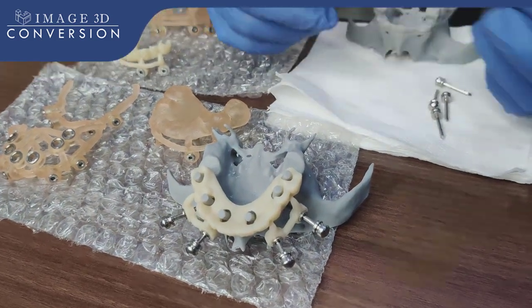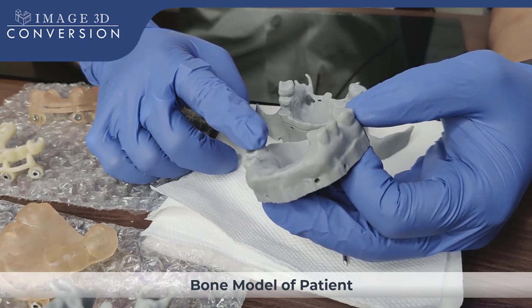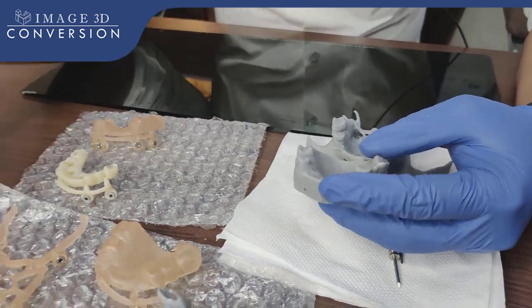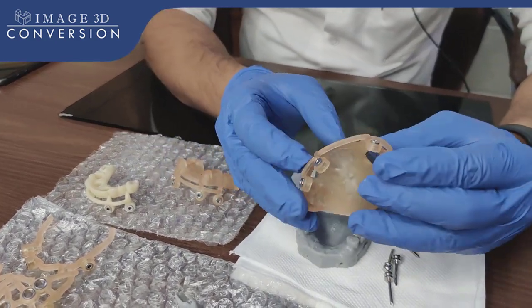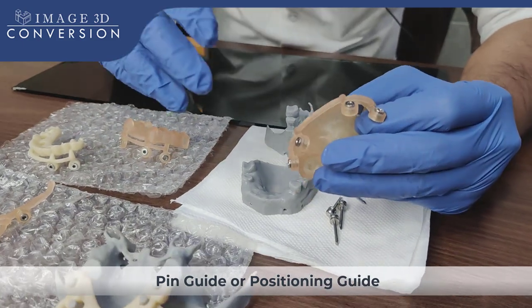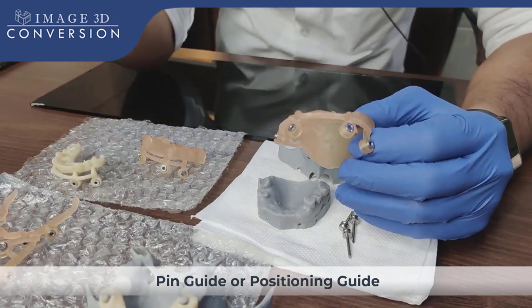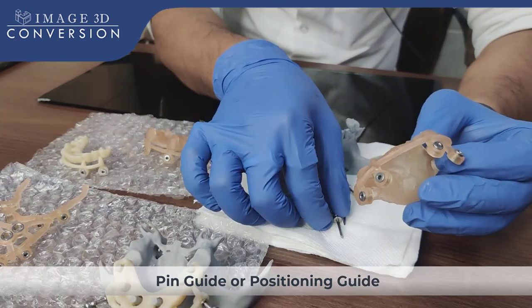This is the model we have. This is the intraoral scan — we had to superimpose this intraoral scan over CBCT using the software. We use Blue Sky Plan software. If you go through our previous videos on full arch bone reduction cases, you will get to know what sequential guides are and how they should be used.